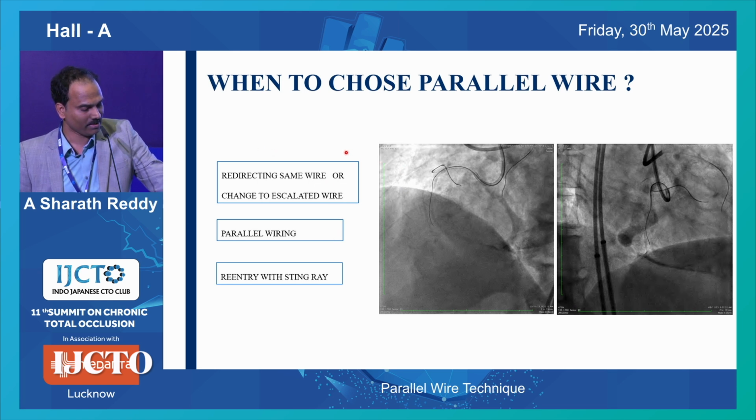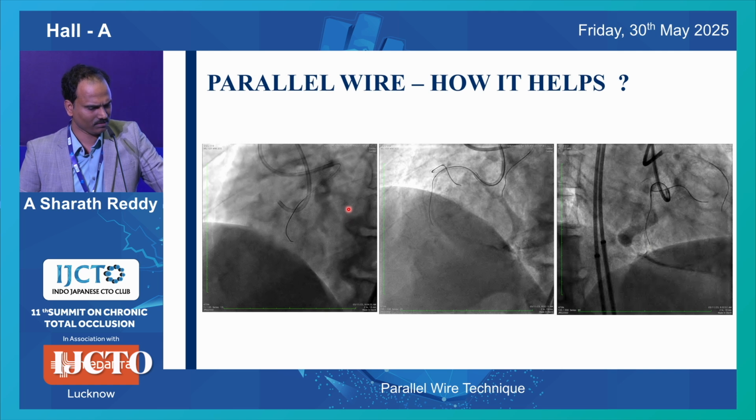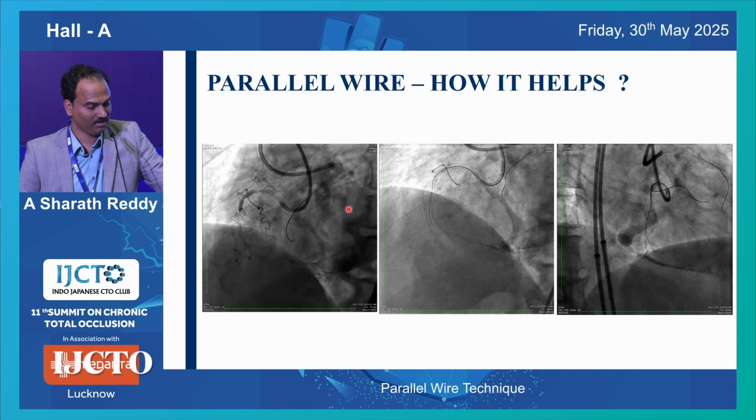And redirecting wire, but these three techniques are mutually exclusive. If you try one technique longer, the other two techniques don't work because of subintimal space expansion. That is something we have to keep in mind. So in this case, you can see the wire is clearly subintimal.